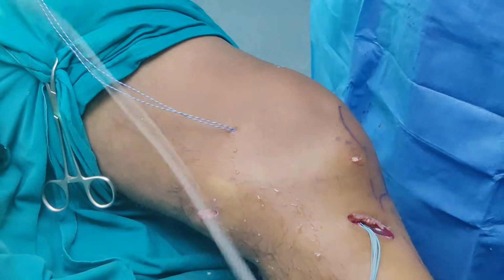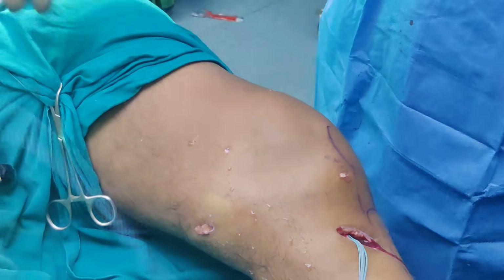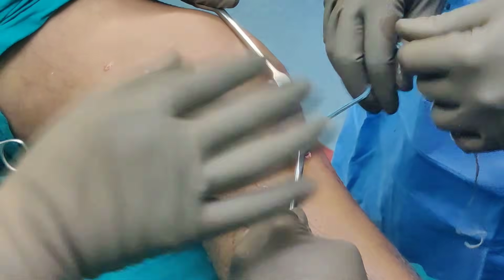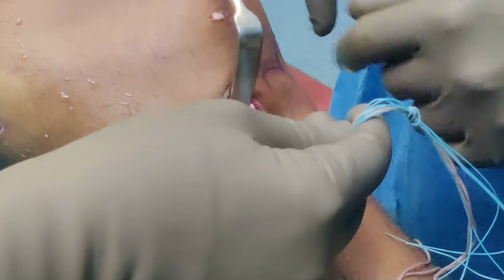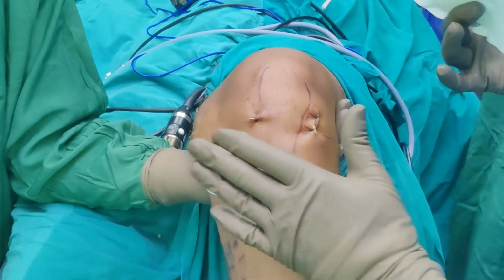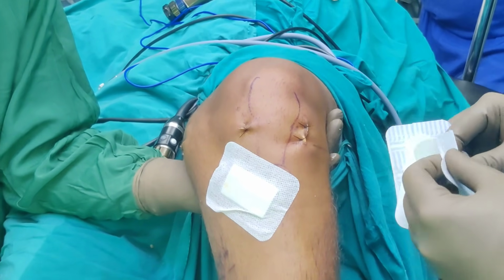So we are going to take this off, and you should not be using it, but this fiber wire can be quite handy to create a loop endobutton if you're fixing a coracoclavicular ACJ dislocation. So I'm just going to cut this, then routine closure, and that's the end of the operation. So this is all skin closed. So this is our site where we harvested the graft.